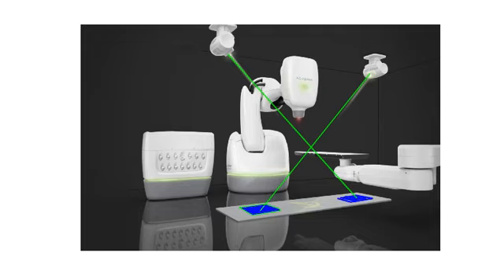And that can give you a stereoscopic localization. So you imagine if you have a point, if you have an image of it from two angles, you know where that point is in three-dimensional space. So that's how that works. So it's very good for bony anatomy and other fiducials and so on that can be visualized on planar radiographs.